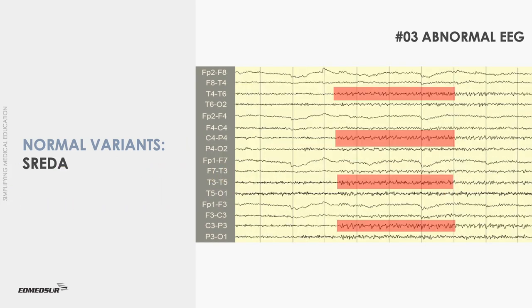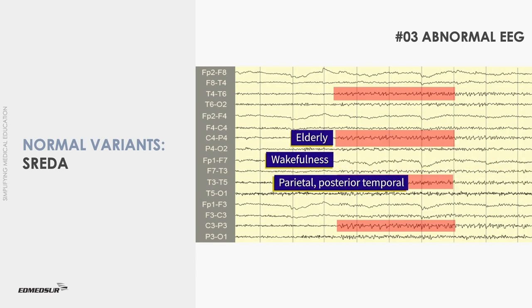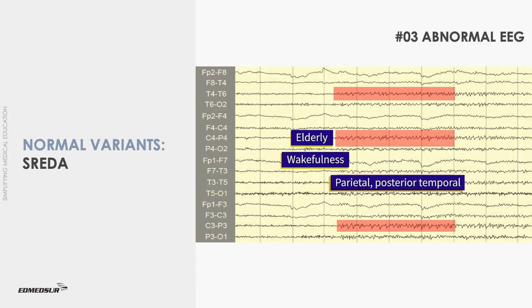The typical pattern of subclinical rhythmic EEG discharges of adults consists of sharp theta waves. Their duration varies from a few seconds up to two minutes, and they either end abruptly or gradually diminish and merge with the background. They occur mainly in elderly individuals during wakefulness, during or shortly after hyperventilation, and occasionally during sleep. They are seen maximally over the parietal and posterior temporal region, mostly in a bisynchronous and symmetrical manner.